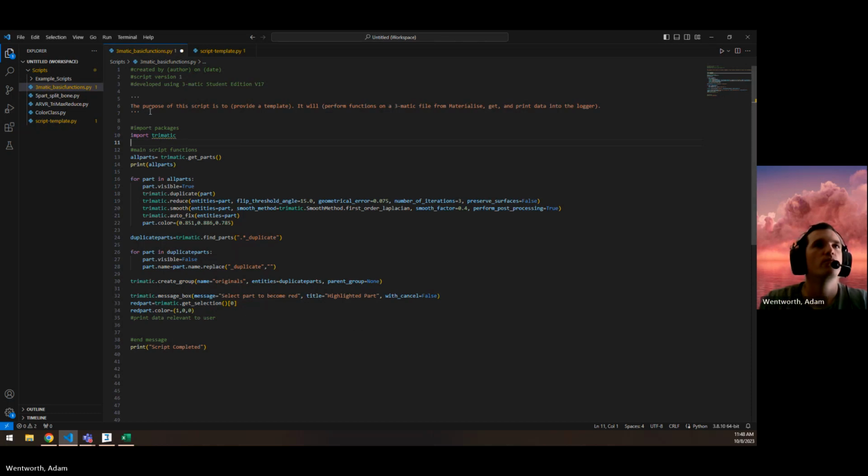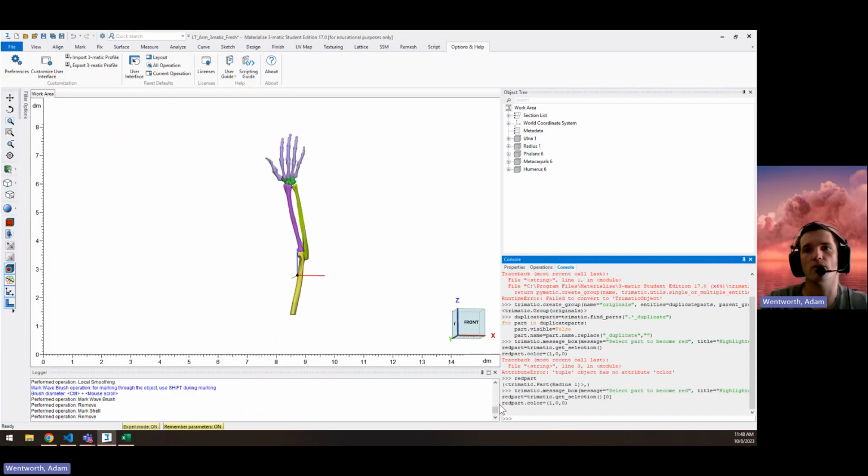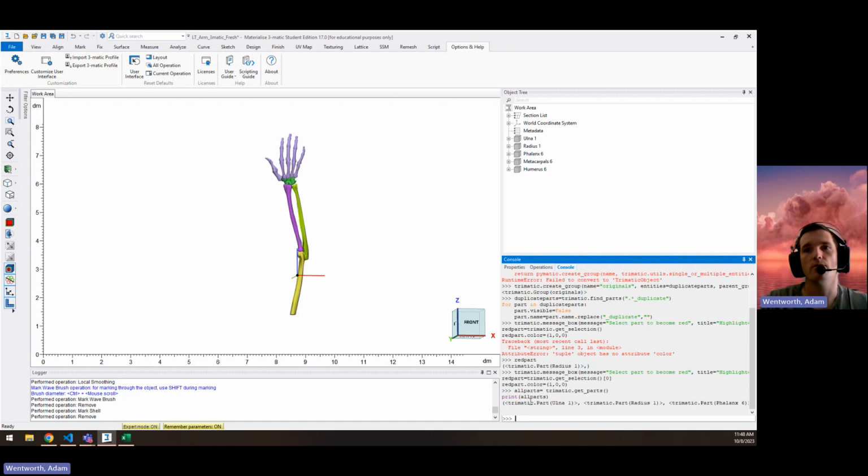So what we're doing initially is, if we want to do functions on all of the parts, we have to get a list of all of the parts, and this is the function that does that. Trimatic.getParts will give us a list of all the parts. So what we're going to do is just copy these functions, and we can go paste them into the console over here, and we'll see that it returns a list of all of our parts here. So I've got all the parts and printed it out, and here's the list.